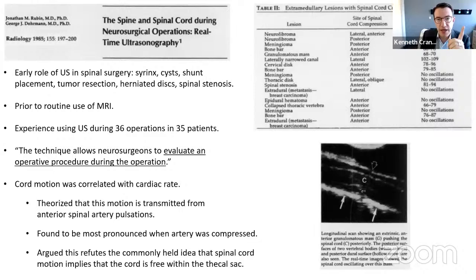And one thing that I'll also mention, based on Jens's question about whether or not it changes our decision making, in this series, where there were the 3 cases, it helps if you do have a kink in the dura, it's very easy to look with the ultrasound and make sure that the spinal cord looks good.